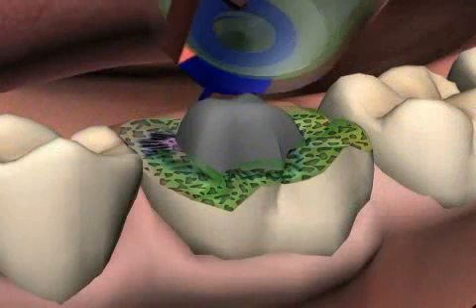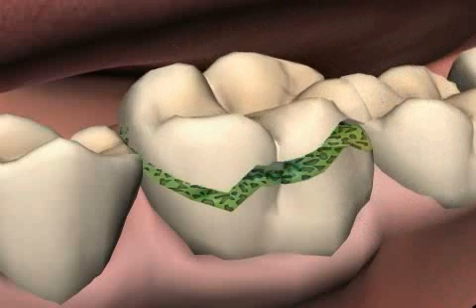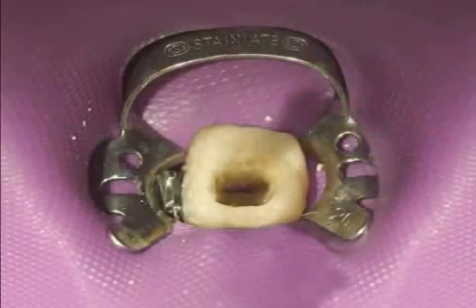Although this is only a rough outline, you can clearly see that the gluing of dental fillings is an elaborate process. Good bonding results can only be achieved if the instructions of the manufacturer are followed, and if the tooth remains clean throughout the procedure. This is why one should always work with a cofferdam.